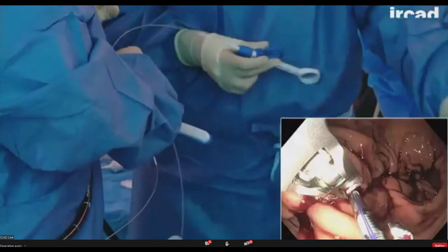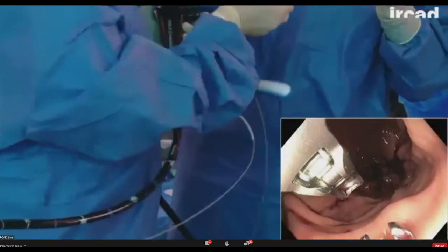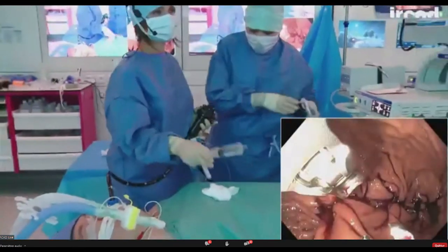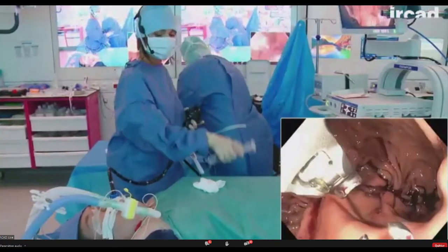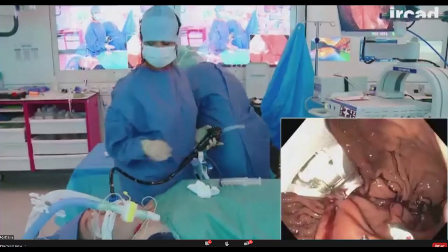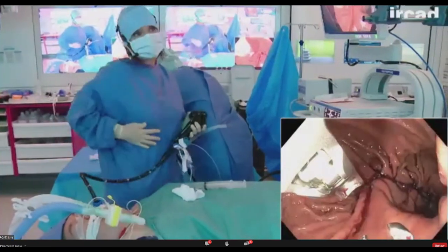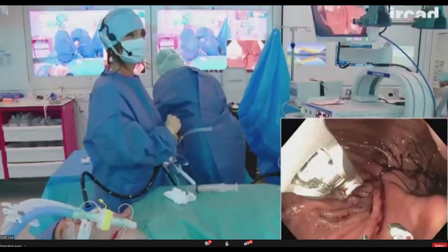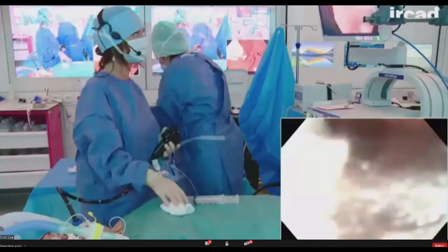Okay. So again, these are some questions being asked in a different way. Are we concerned with tearing the mucosa? With tearing the mucosa? Not really. If you tear the mucosa, it bleeds. So you have to be prepared for that. Another cinch, please open it.